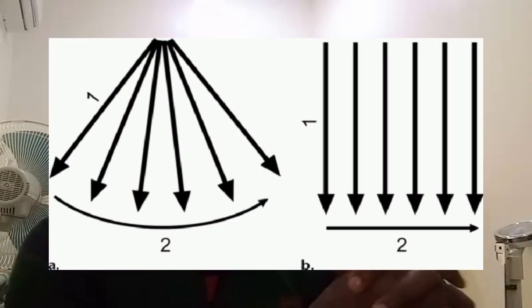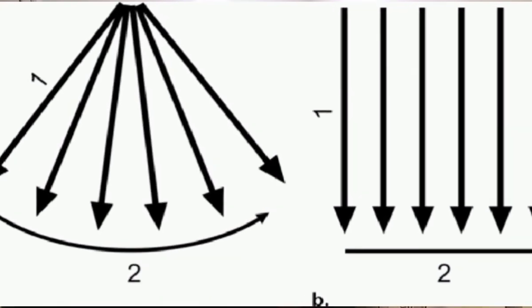The distance of the dot from the transducer is determined by the ultrasound pulse travel time, which we call the go-return time. This image will show you the scan lines and echo amplitude strength vis-a-vis brightness.